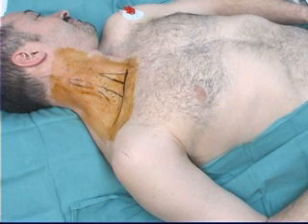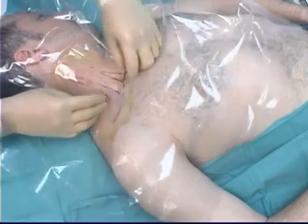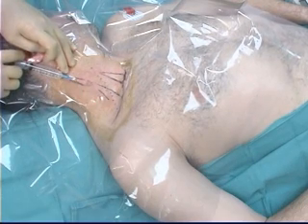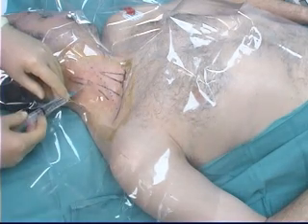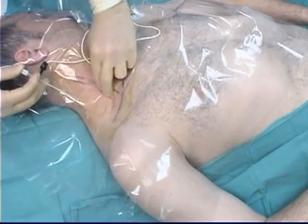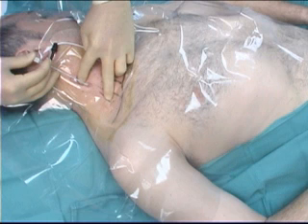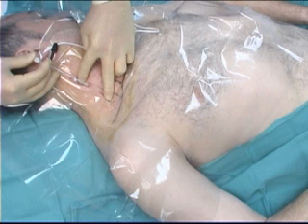The landmarks are similar to those for a single injection interscalene nerve block. Cover the area with a fenestrated clear sterile plastic drape after skin preparation. Perform a superficial cervical plexus block and also anesthetize the path intended for subcutaneous tunneling, in this case towards the suprasternal notch. Make sure the external jugular vein is not injured by going deep to it. The nerve stimulator is set to a current output of 1 to 2 milliamps, a frequency of 2 hertz, and a pulse width of 200 to 300 microseconds, clipped to the proximal end of an insulated 17 or 18 gauge Tuohy needle. The interscalene groove is palpated with the middle and index finger, with the fingers split to put traction on the skin while leaving the middle finger in the groove.